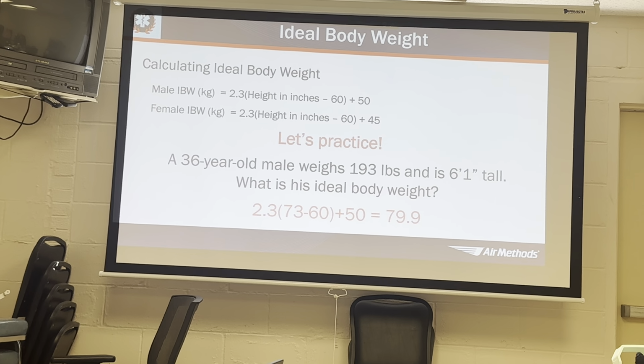So, Tiffany, I have a question. You guys do all that? We do, we actually have a chart on our vents. I figured. Also, our newer vents will calculate that for us. We can put in gender and height, and then it will tell us what your ideal is. Does it use 6 mLs, 6 to 8 mLs? Yeah. And how does it know which one?